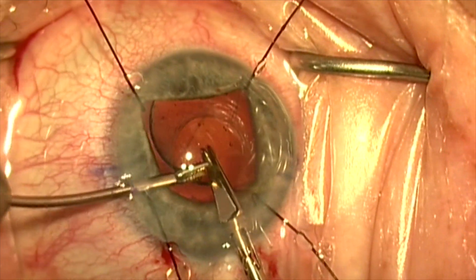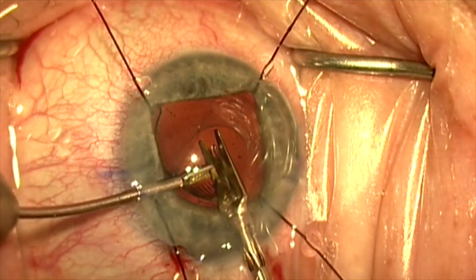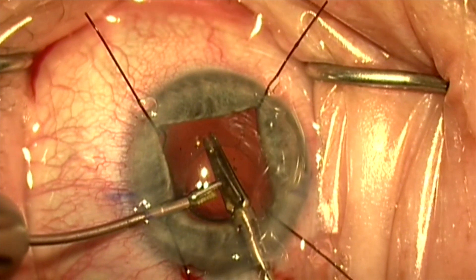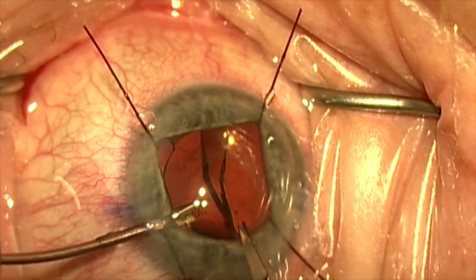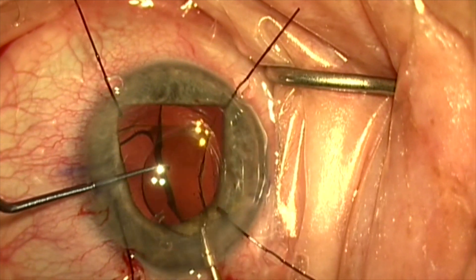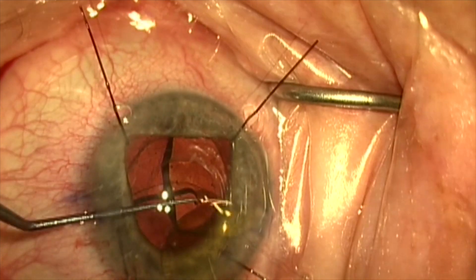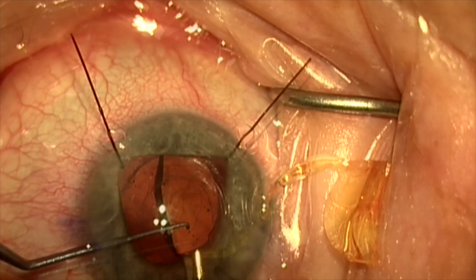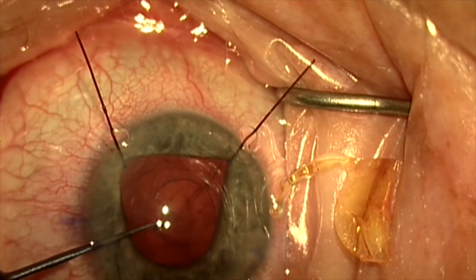I'll place a little viscoelastic under the lens to push the posterior capsule back and create some space. Again, this is a small eye with a small anterior chamber. I'm going to hold the lens and cut the lens in half within the capsular bag, being careful not to damage the anterior or posterior capsule. You'll see me turning the scissors sideways a little bit as I do this. Now that the lens is cut in half, it'll be relatively easy to bring it up out of this small anterior capsule opening and take it out through the main incision. There's the first half of the lens, and now the second half comes out very easily.